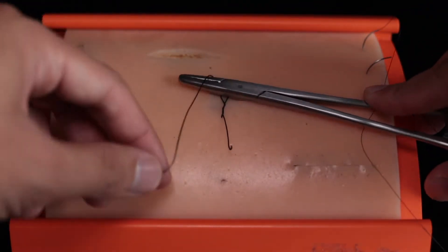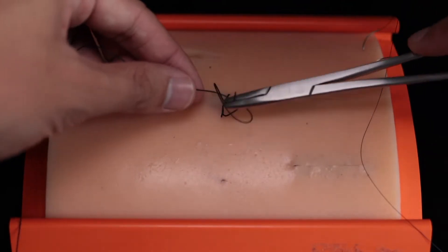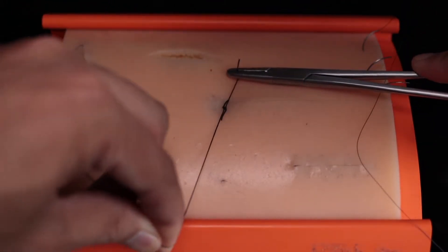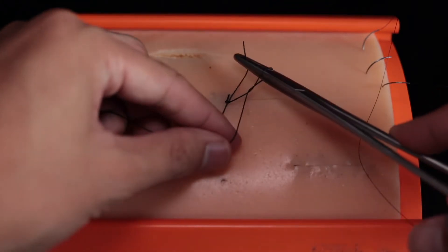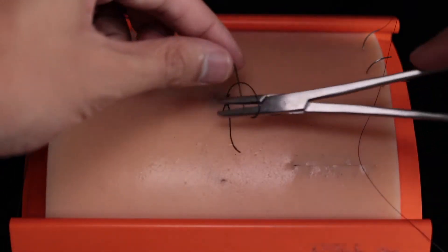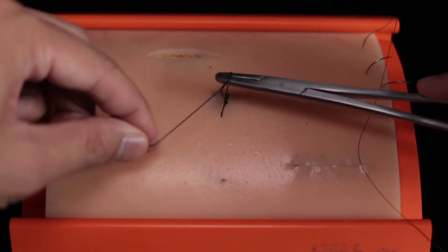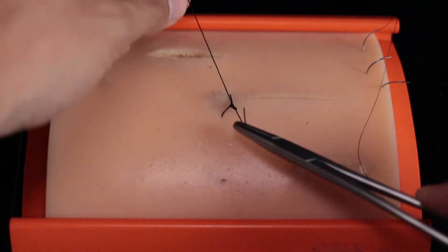For the following throws, you're just going to wrap it around once and pull through, repeating these steps about five times: needle driver in the center, wrapping the suture around the needle driver, grabbing the free end, and pulling through. And that's the basic instrument tie.